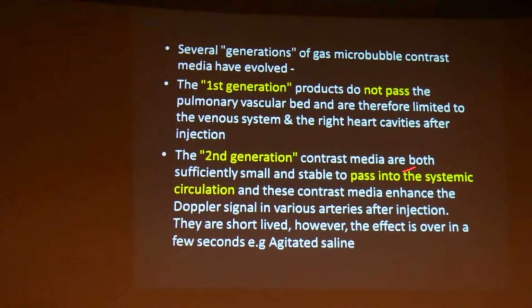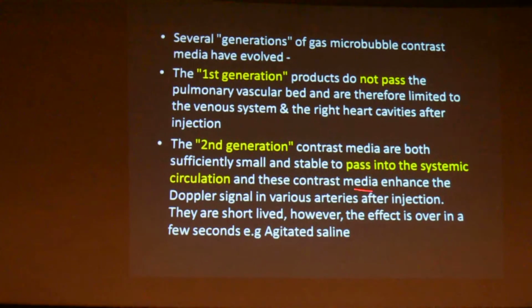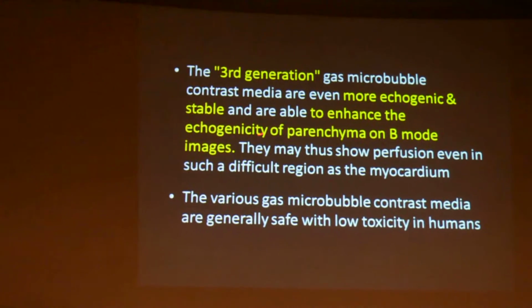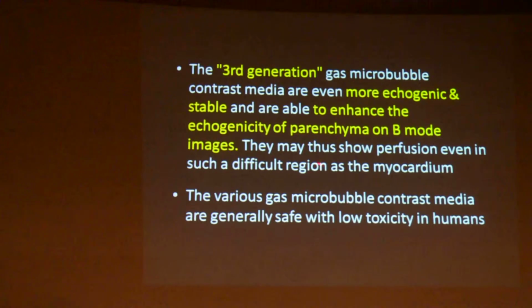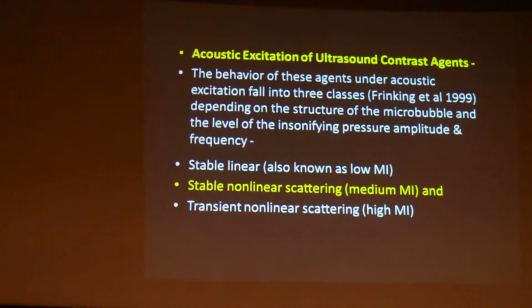The second generation is the contrast media that are sufficiently small and stable to pass the systemic circulation. And the third generation is more stable and echogenic, and they can pass the pulmonary vascular bed. And there are various microbubbles which have low toxicity in human beings.